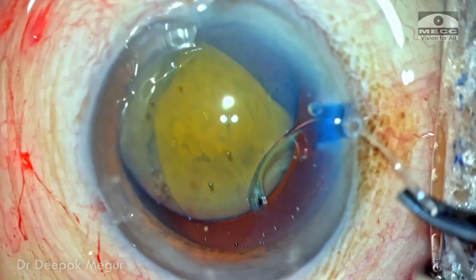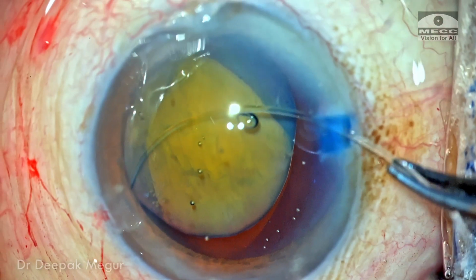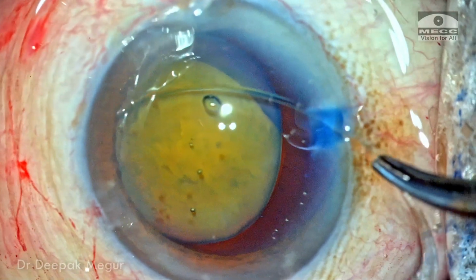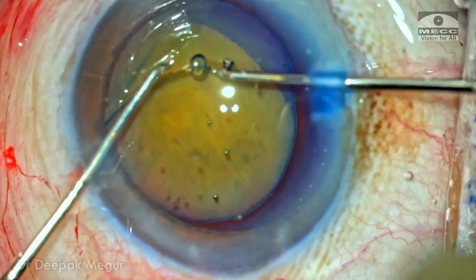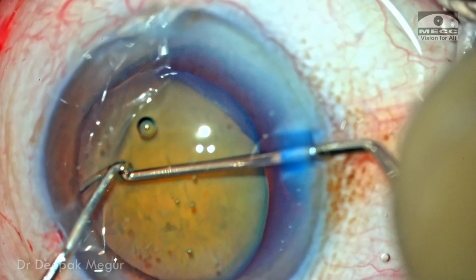My preferred technique is always the bimanual method. Care is taken to ensure that the area of zonular weakness is adequately supported. So I'm just dialing the ring to the appropriate position. So this has ensured that the capsular bag is well supported by the capsule tension ring.